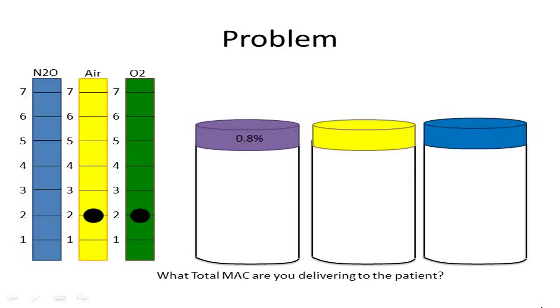Well, you've got the semi-open circuit, which you're always going to have the air coming in at a constant rate. So at 4 liters per minute, but you're not going to overbreathe that. Actually, 2 liters per minute is just fine to run your flows at. Wouldn't that depend on your FiO2, the smaller amount of the total volume of the oxygen? You have a certain requirement of oxygen per minute, 250 mLs per minute, which is a quarter liter per minute.